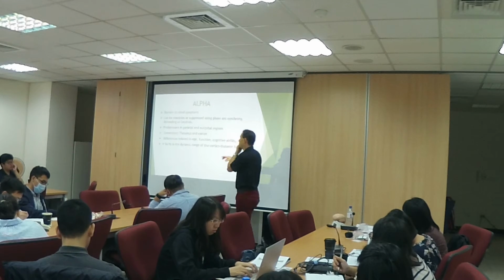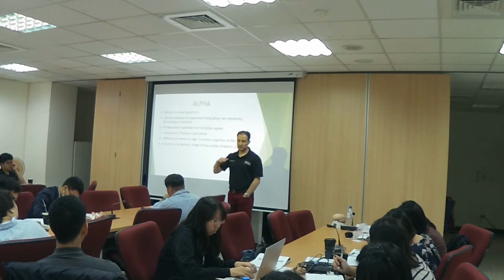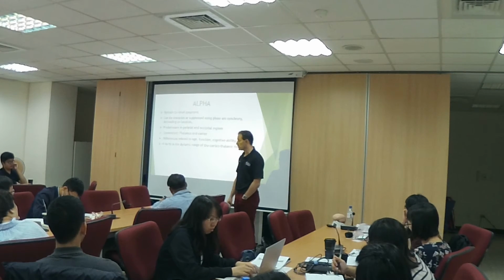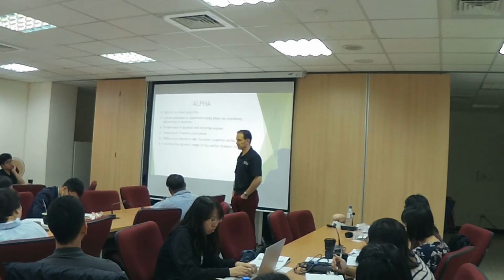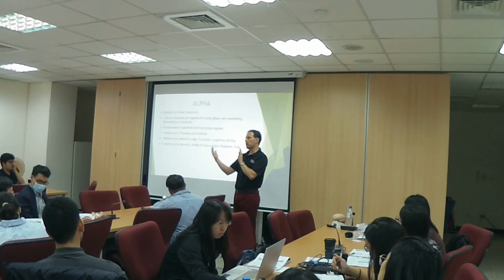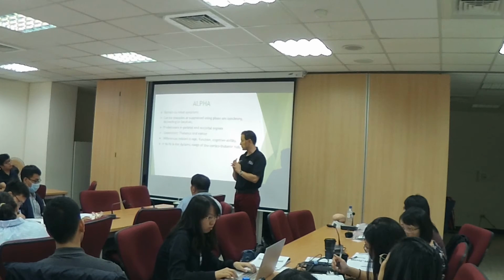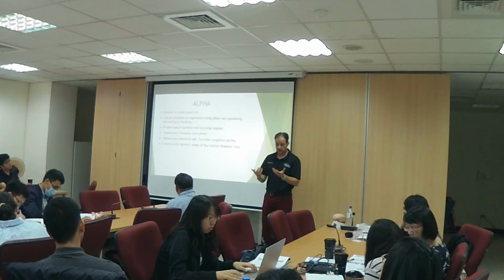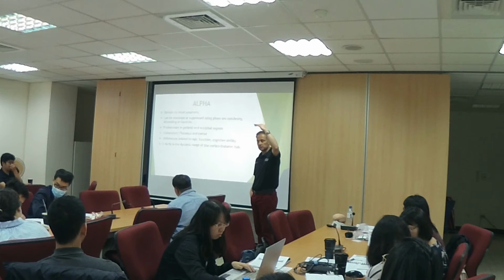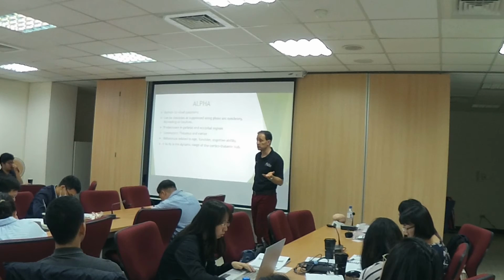And normally, what do you train? Well, if the alpha is slow, you down train the alpha. If the delta is slow, you down train the delta. If the theta is slow, you down train the theta. And normally, what you want to reward is 12 to 15. You normally inhibit anything that's too high, whatever you see on the EEG, and then you reward 12 to 15. And that really helps you. And there's some literature that talks about IQ points being increased with neurofeedback. It's somewhere between 4 and 10 points, which is very significant. So you can increase IQ in a person with neurofeedback.